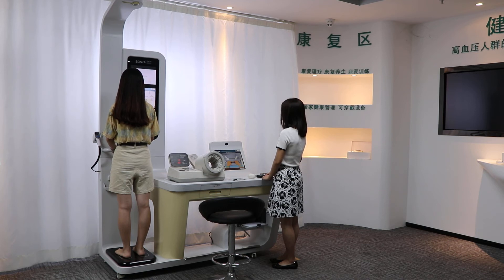Now, body composition. The person needs to grasp the two handles on the machine.